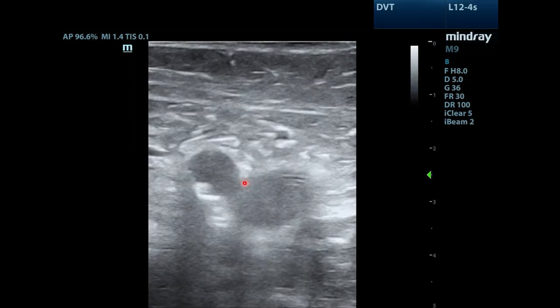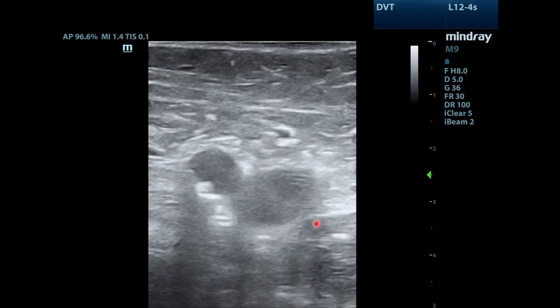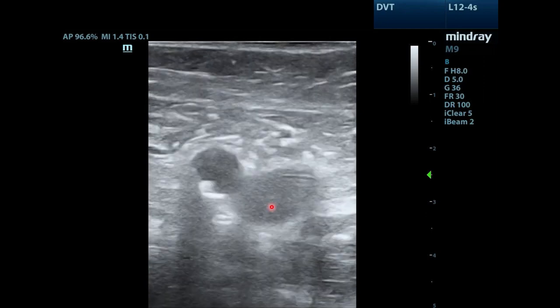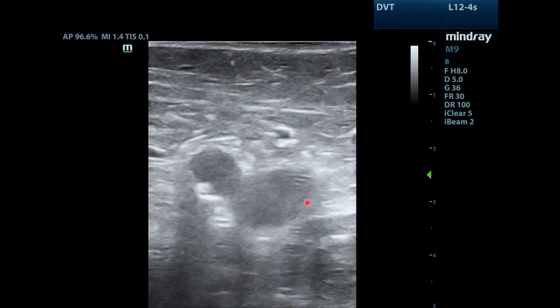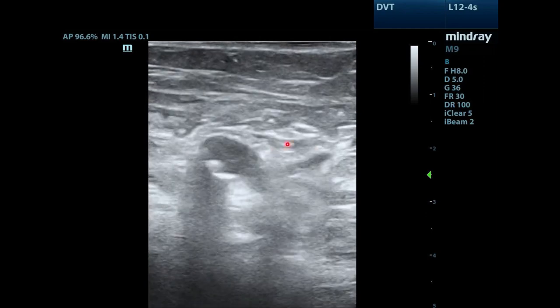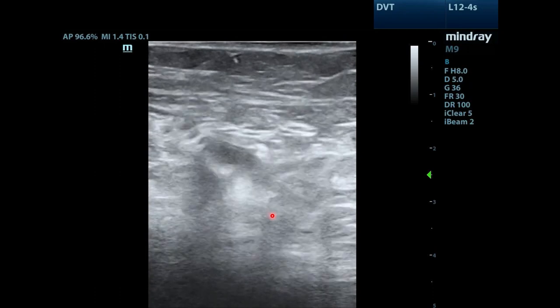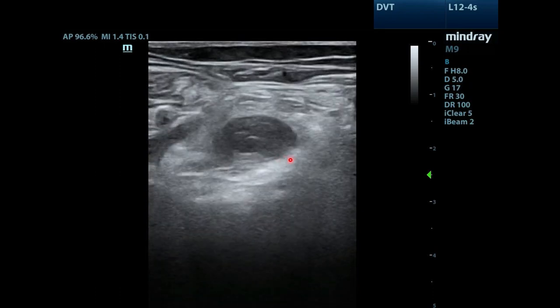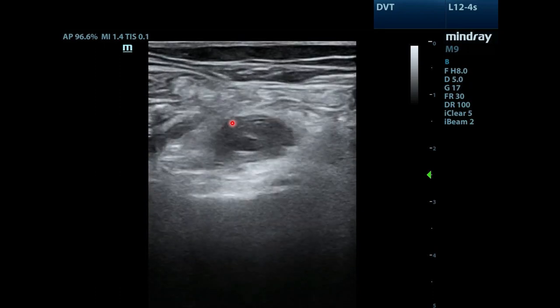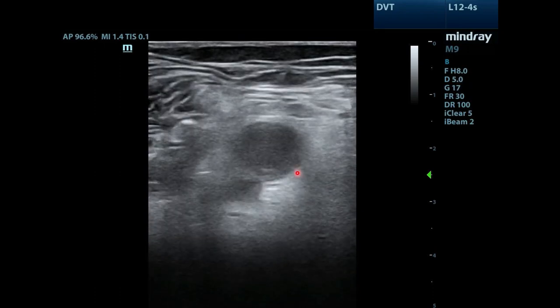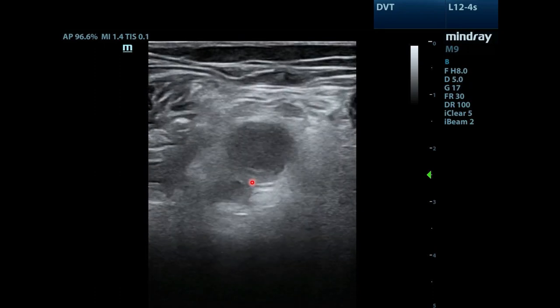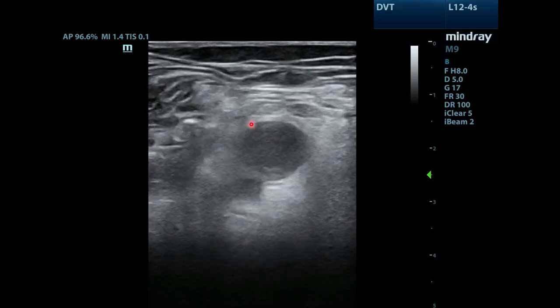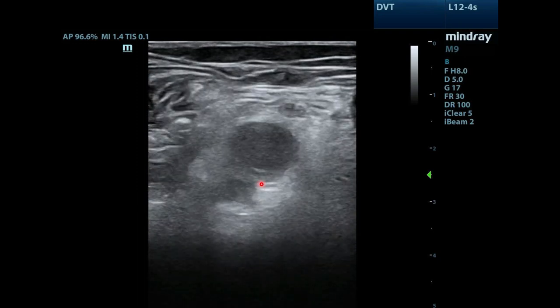Moving to the legs, this is an abbreviated version of the DVT exam. You'll notice complete compression of the vein here. Moving to the popliteal fossa, notice that the popliteal vein has a thrombosis in it.